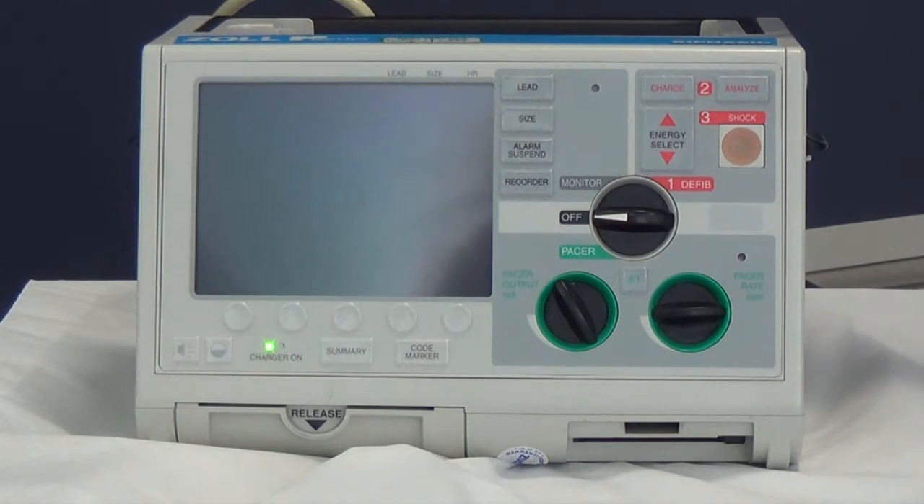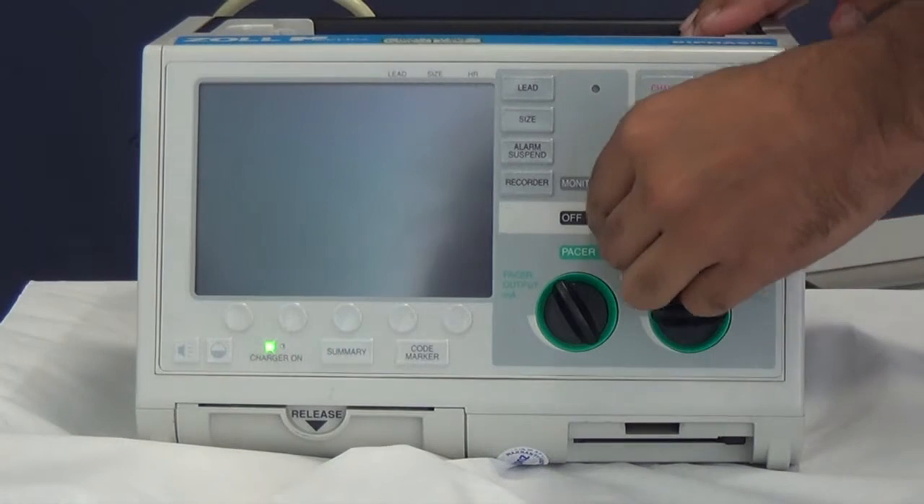This is a defibrillation machine to be used in an adult cardiac arrest situation. When you've arrived at the cardiac arrest and the CPR team is already there, attach the leads in the appropriate place and turn the monitor on to the defib mode straight away.